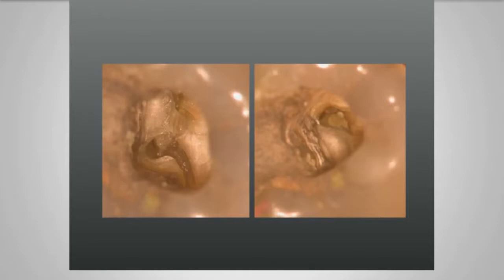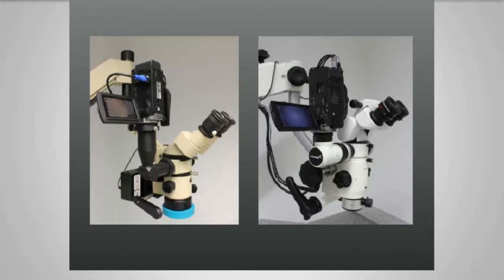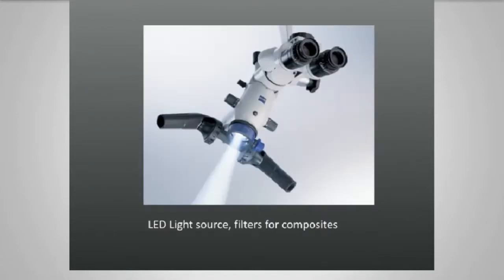In endo practice, as I've said, we use a microscope, and these are the microscopes that I use in my practice. We have video cameras, and you'll see some of the video footage from these during the presentation. The nice thing is that you get some LED illumination down the field of view, so where you're looking is highly illuminated, and this is what you're trying to get with the headlamp on your loupes. And here you can see the illumination, the LED illumination simulated from this microscope.